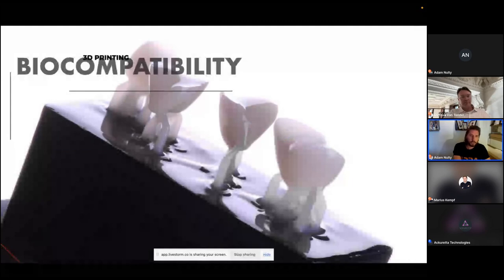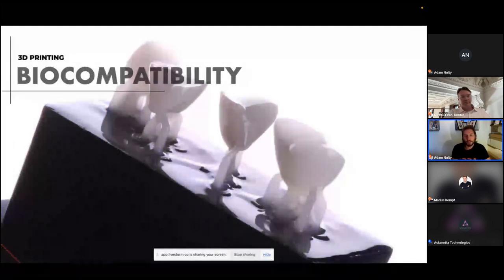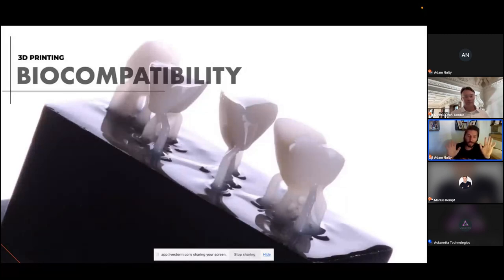Yeah, and we alluded to it before, but one of the most important things that we're going to deal with when we talk about 3D printing in dentistry is biocompatibility. I know firsthand how that can affect you, because I've been messing around with 3D printing so long I've developed a reaction to 3D printing resin on my hands. I get really dry hands now, even with just the littlest bit of resin through my gloves. It doesn't even have to be without my gloves. It just soaks through for some reason. Even a minute amount now sets it off, becomes very itchy, becomes very dry.